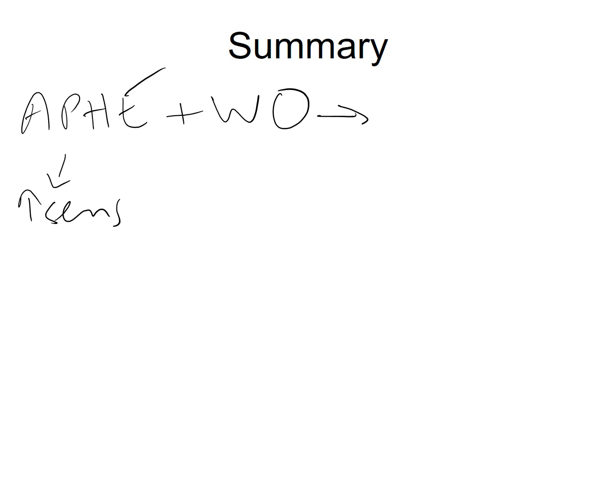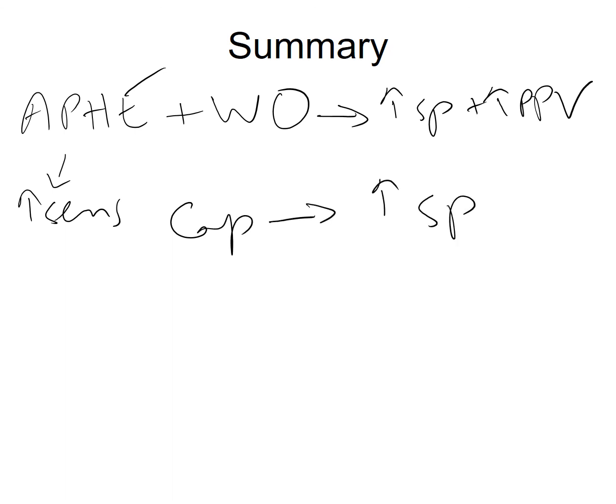Now, in summary, arterial phase hyperenhancement is a highly sensitive feature, and when combined with washout it gives high specificity and high positive predictive value. The presence of a capsule is a very specific feature. The other features that suggest malignancy are increased size and increased interval growth.